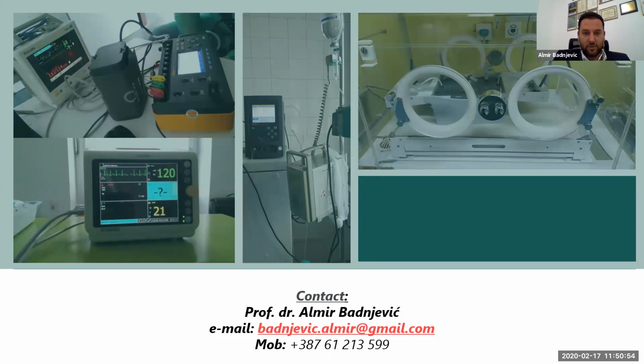Are you running a calibration service? No, the calibration service is run by accredited laboratories, which exist all over the world, and also by the National Metrology Institute of each country.